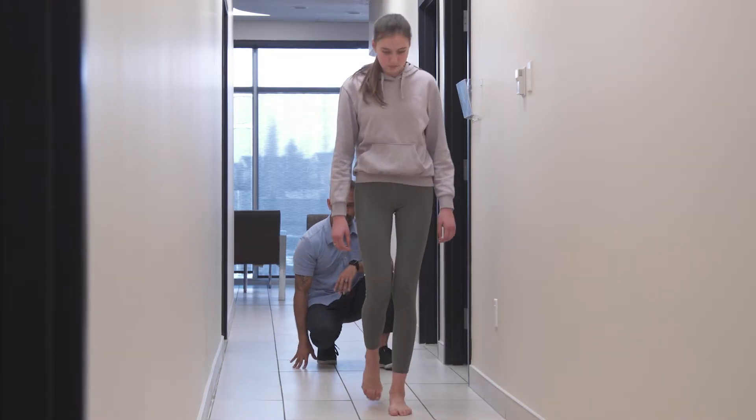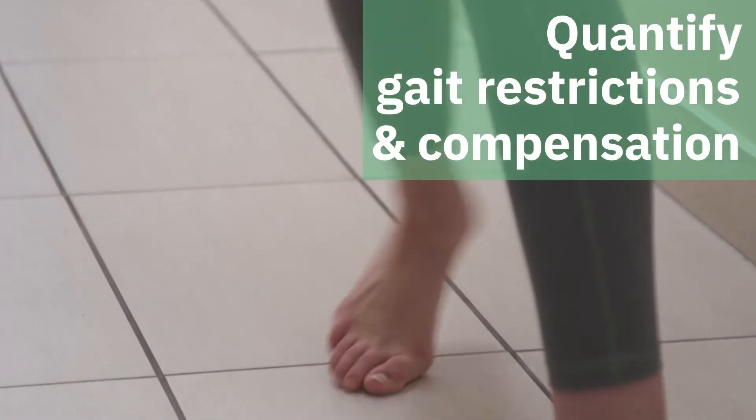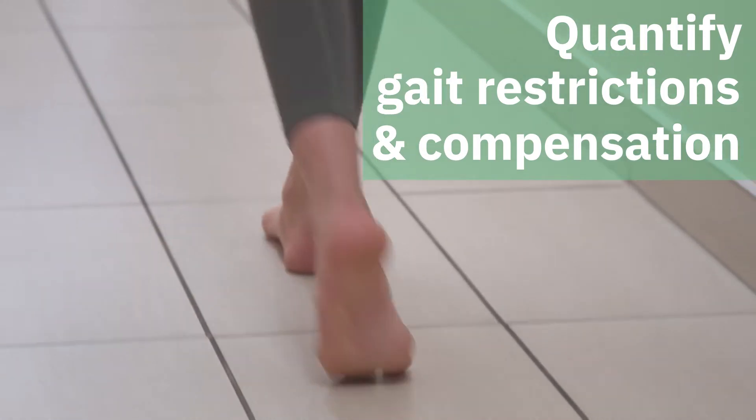Without the ability to easily quantify changes in gait and plantar pressure, there is no way to validate clinical hypotheses to improve functional gait, comfort, and safety.